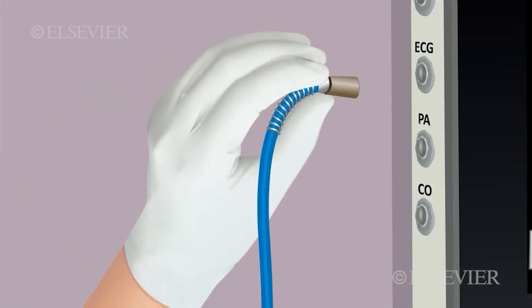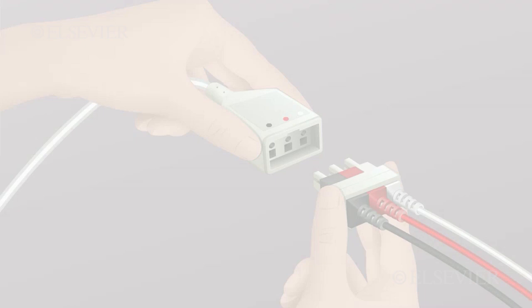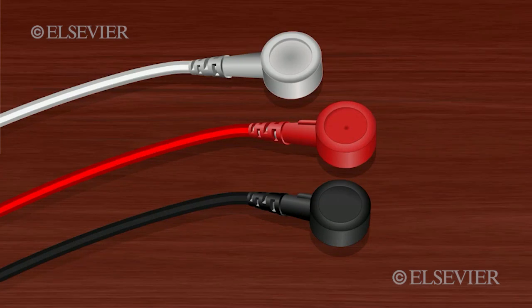Plug the patient cable into the monitoring system or telemetry transmitter. Check that the lead wires are plugged into the patient cable correctly and securely. Manufacturers identify the lead connections by color, letter, or symbol codes.